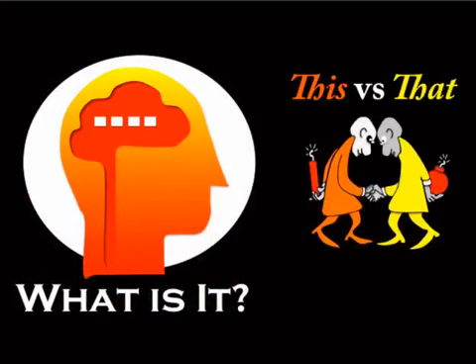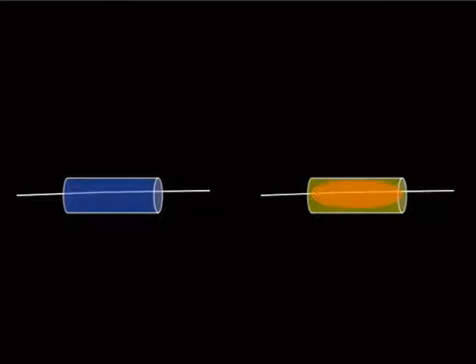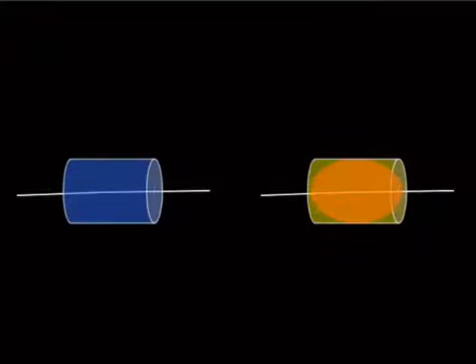All right, so moving on. Let's talk about 2 different kinds of stents. We've got self-expanding stents, and we've got balloon-expanding stents. Some general tips on angioplasty. The balloon should be big enough to take out the stenosis and stretch the artery slightly. The ideal dilation is about 10 to 15% over a normal artery's diameter.